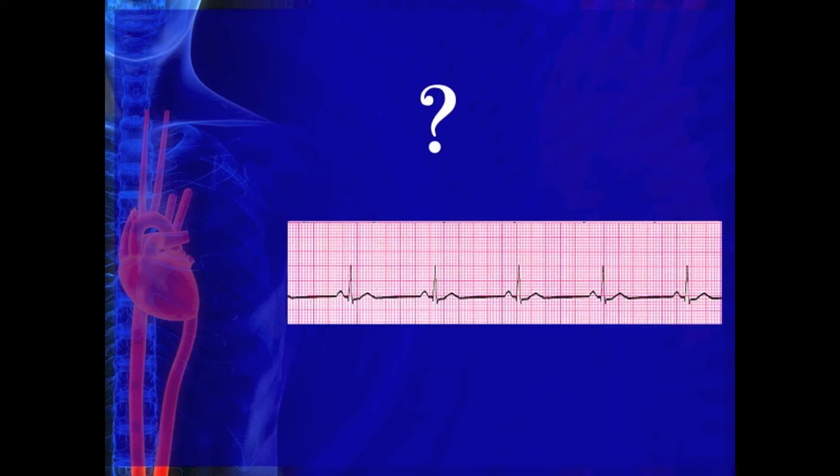What rhythm is shown here? This rhythm could present in a patient as seen in the following footage.